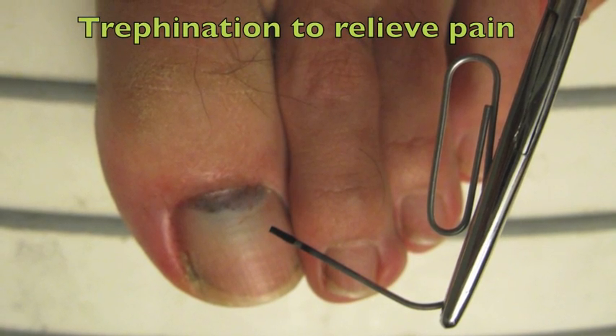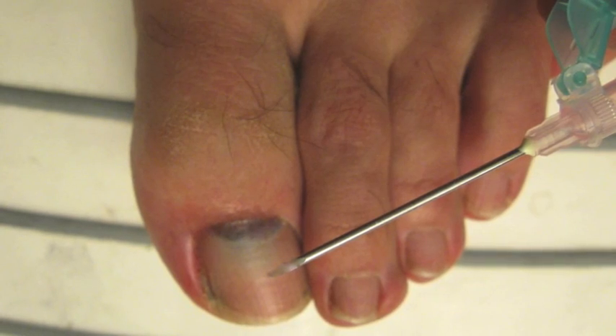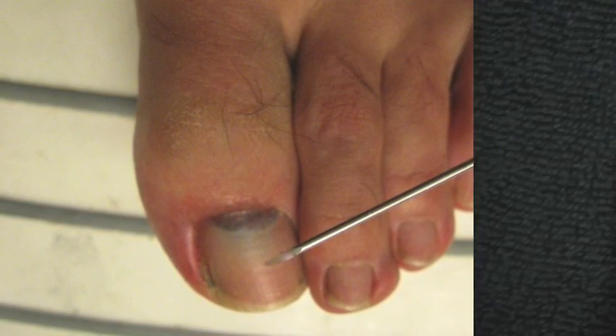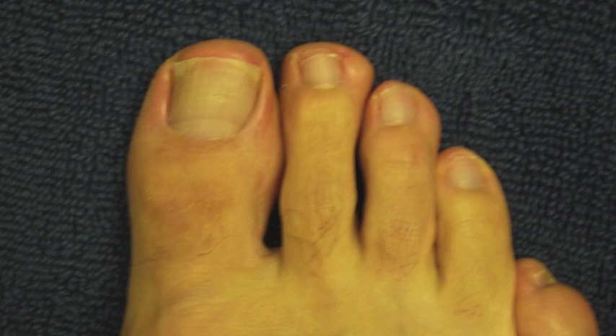Trephination is indicated to relieve pain from the subungual hematoma when the nail edges are unaffected. The decision to perform this procedure is based on the degree of pain rather than the size of the hematoma. The drainage will not prevent any local infection and will not facilitate healing — it will only relieve pain.